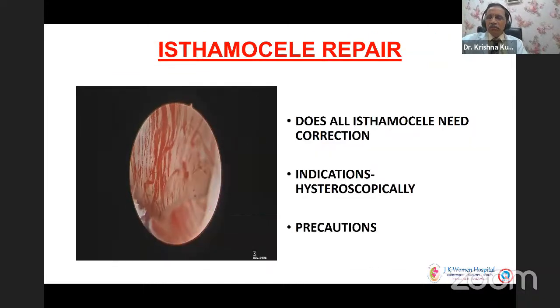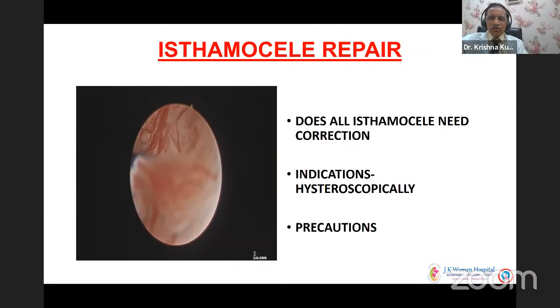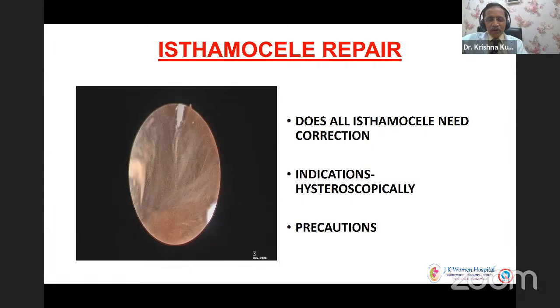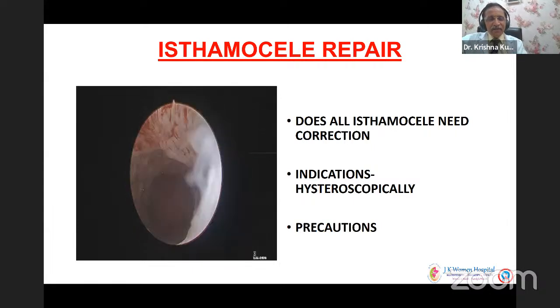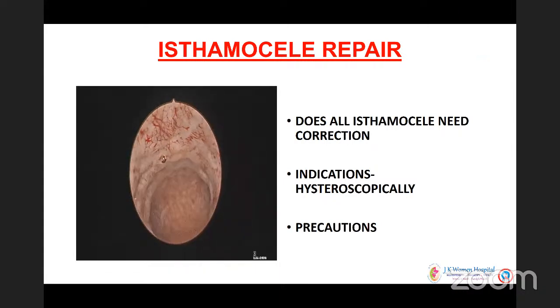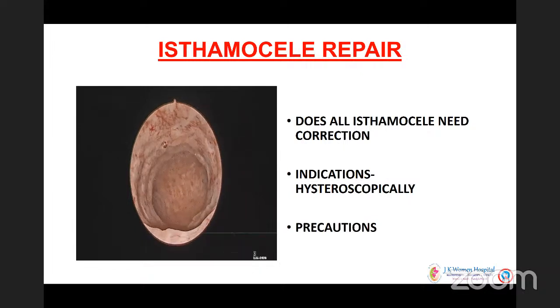But isthmocele, we get a lot of isthmocele now. Does every isthmocele require correction? What is the indication again for hysteroscopy and what are the precautions? Only symptomatic isthmocele requires treatment. Asymptomatic will not require it.